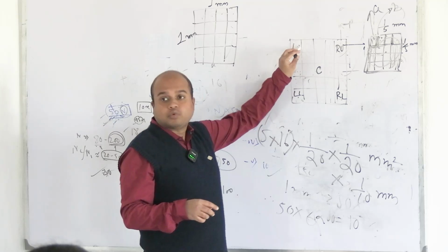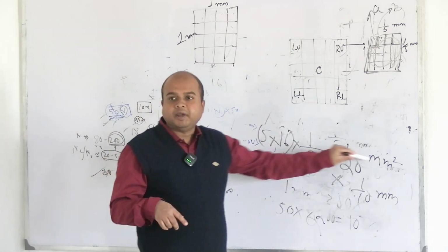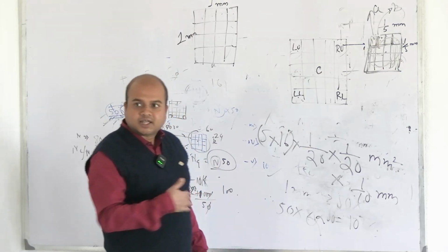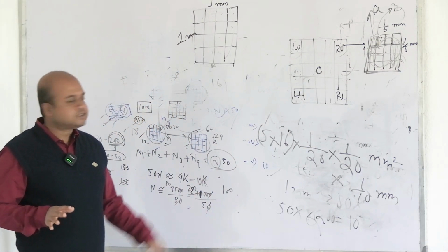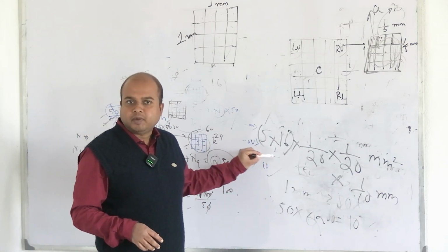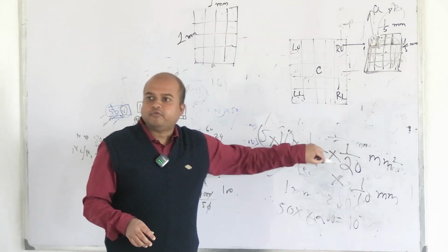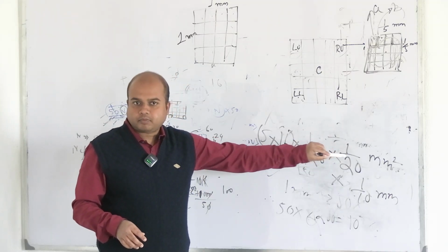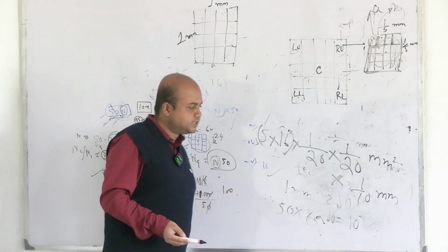This left upper square as a whole, I am actually counting 16. So better it should be written like this, but the previous calculation is also correct, because I already know the structure of the squares, how it is divided. But actually if I go by the counting, it should be written like this, that 5 into 16 into this is the area of the squares, each square counted. So this will again come to 1 by 50, it has to be the same.